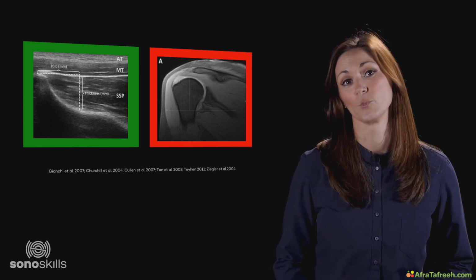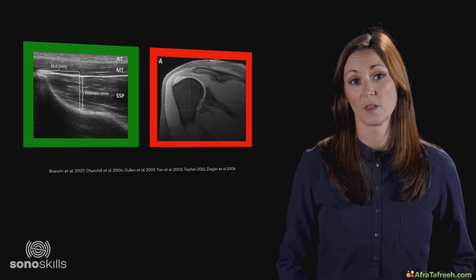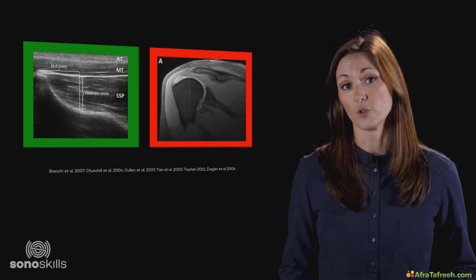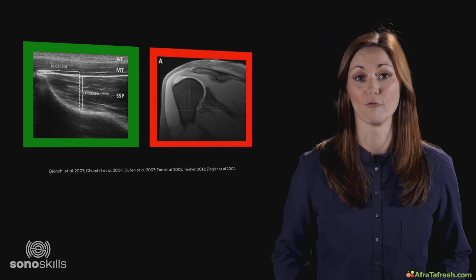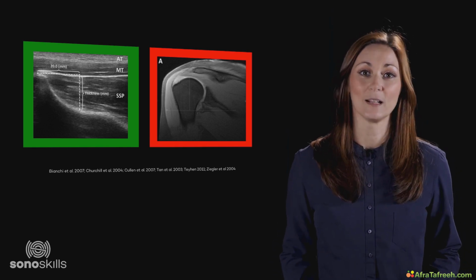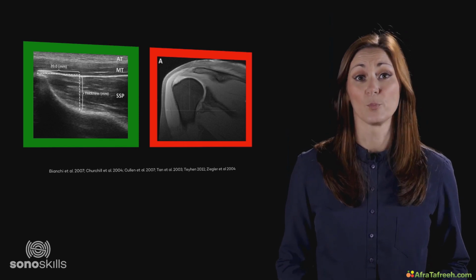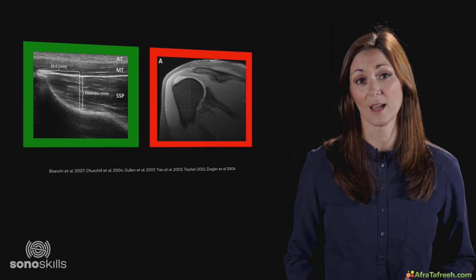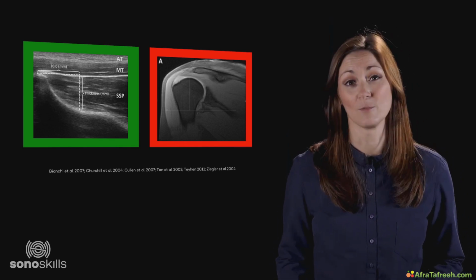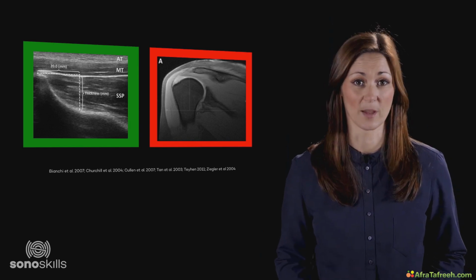Ultrasound is much more accessible than MRI. In many cases, ultrasound is also portable, so you can take the system with you to your patient or client if needed. Or you can easily maneuver the ultrasound system around the patient on its trolley. Once using it, you're not limited to the area of initial interest, as you are with MRI. If you're performing an ultrasound exam of the shoulder, and during the exam you think it might be an elbow problem, you can very easily move from the shoulder to the elbow within a second. This is not possible with MRI.